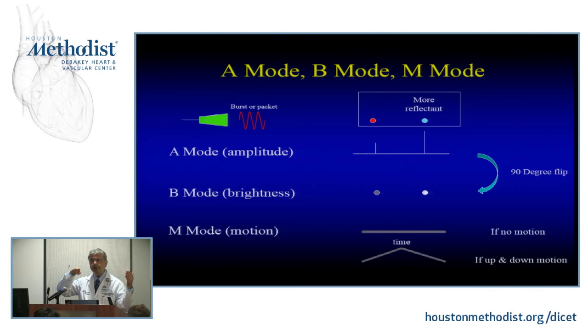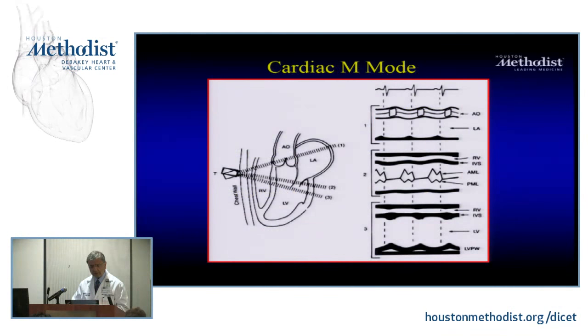if it is not moving, it stays as a line, right? And if it is, let's say, a mitral valve, it's going to go up and then down, and then you're going to start seeing various things that you've gotten familiar to. And this is where it's great for M mode because it has great time resolution, right? And we'll talk about resolutions down the line.